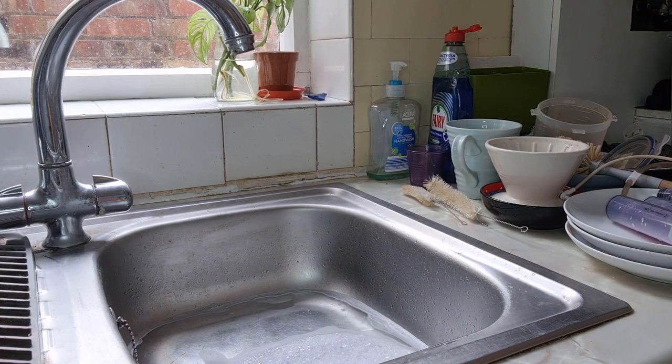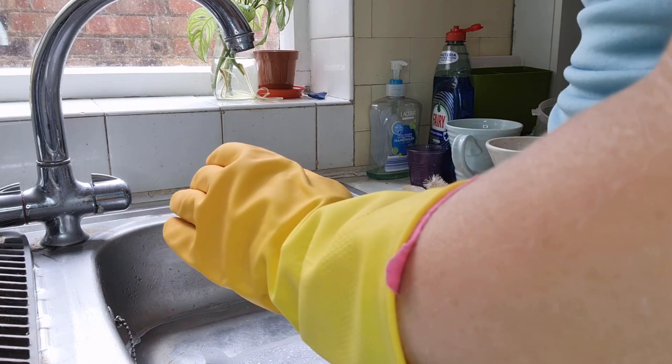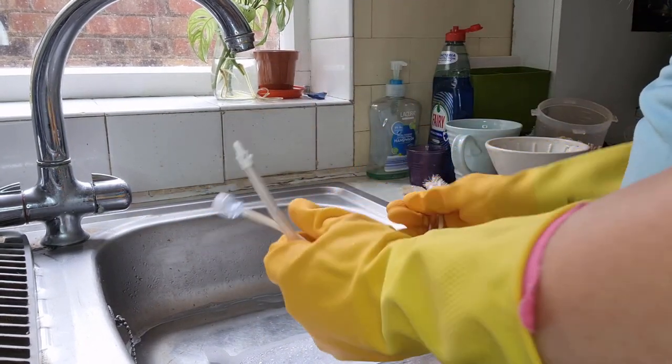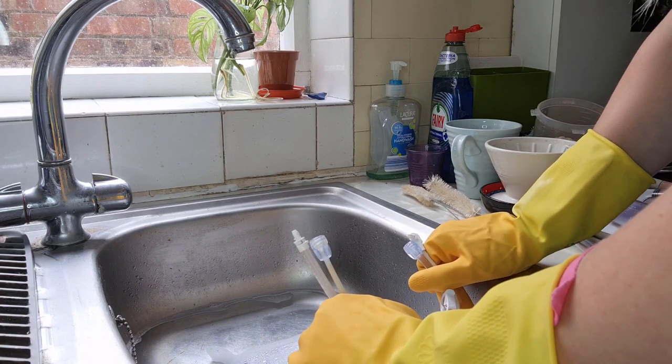Wow, there's nothing like aiming a camera on something to make you think it needs a good scrub! My feeding tube extensions are here, my soap and water is here. Tip number one for cleaning feeding tube extensions is actually: don't bother.